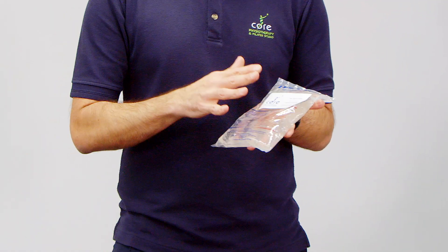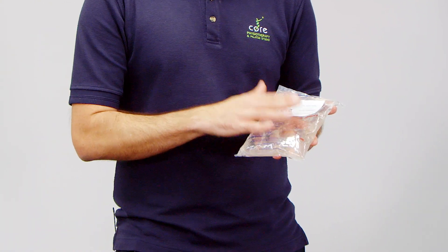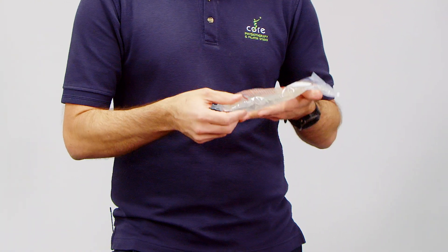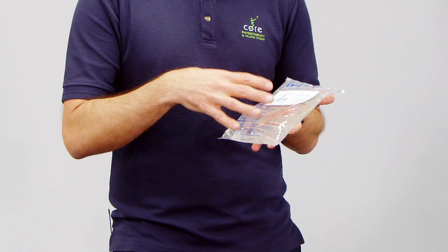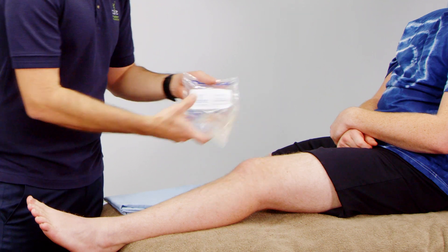Using it as a cold pack is really simple. We pop the pack in the freezer — the gel inside is clear right now, but it actually goes white when it's ready to use. Once it's white, we can very simply wrap it over a joint or any awkward place on the body. It's a really nice flexible material.